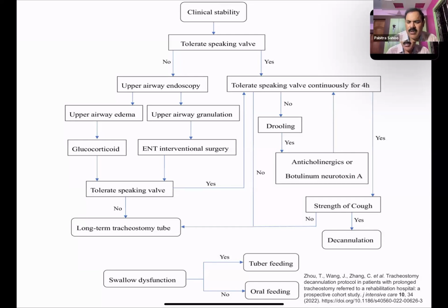Maybe one thing is that in a metal tracheostomy there is an obturator and there are two lumens. Yes, so you can clean the inner lumens and reuse that. That may be one advantage. Currently in all the hospitals in the private setup, sir, we use Portex. That is not reusable, so every 10-15 days you have to change the same size tracheostomy tube.